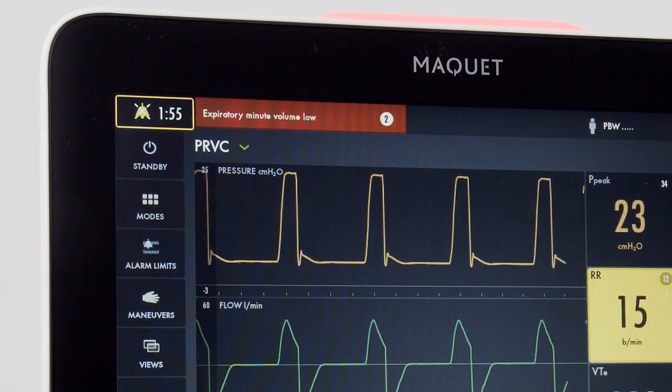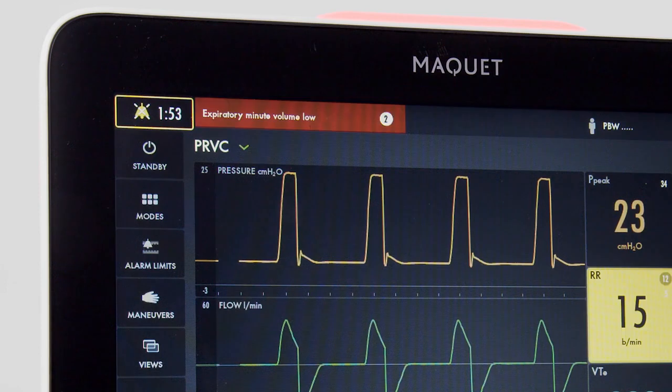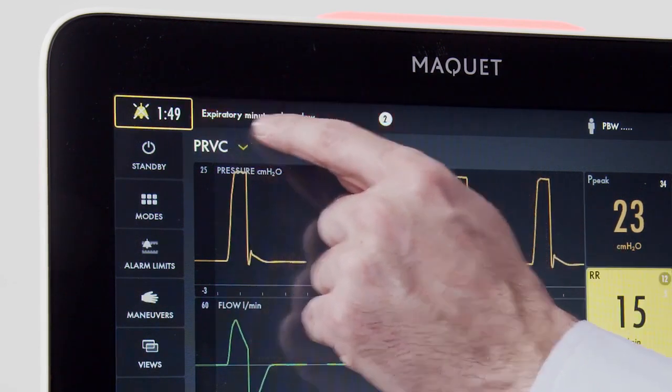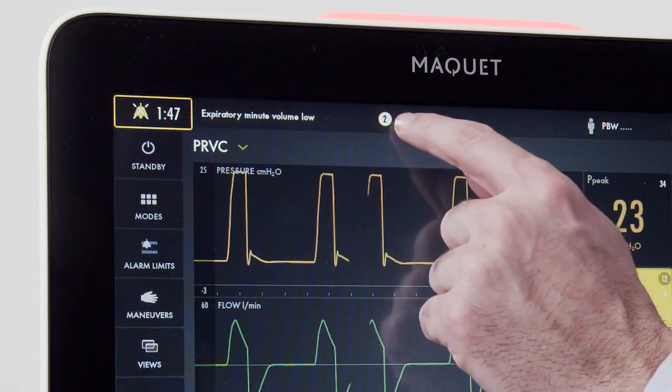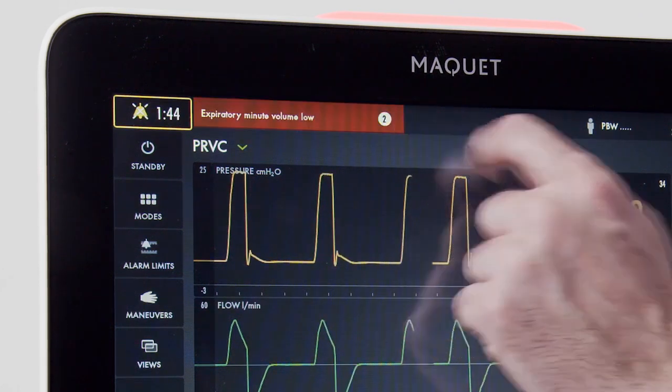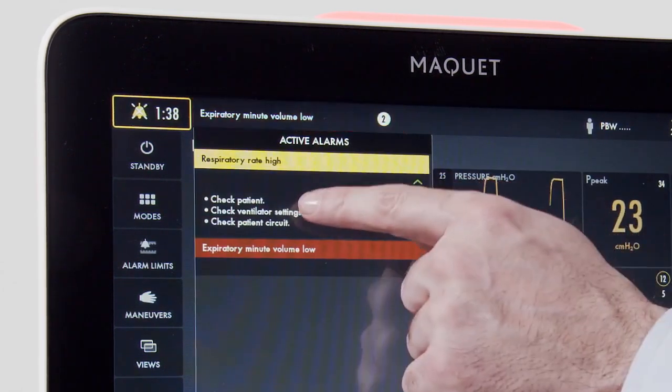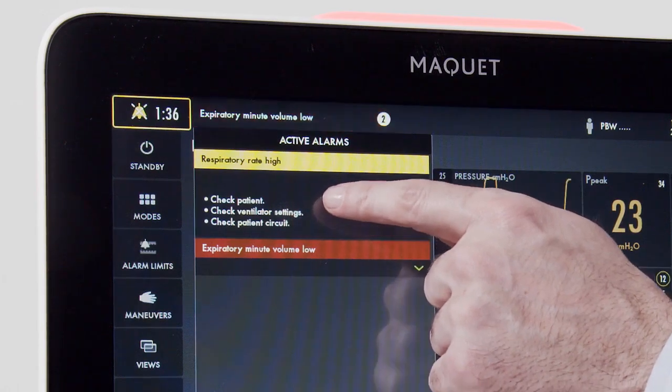There are two spots on the screen that will indicate the alarm. First, we have our alarm information window, which will also indicate the number of active present alarms. Once pressed, the alarms that are active will be displayed, as well as information on remedying the alarms.